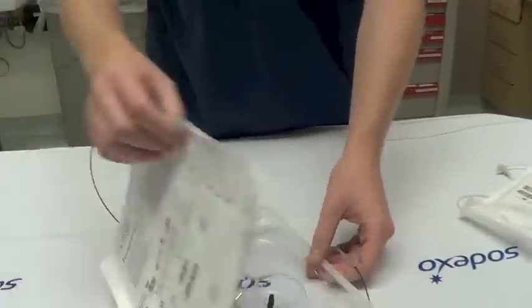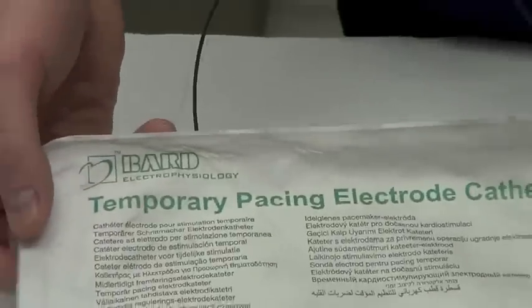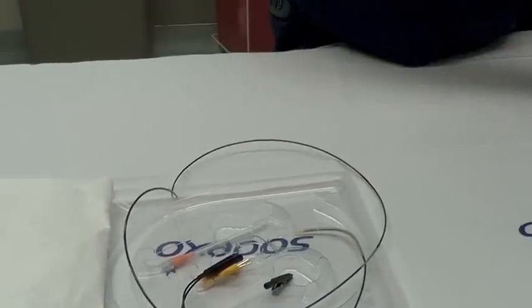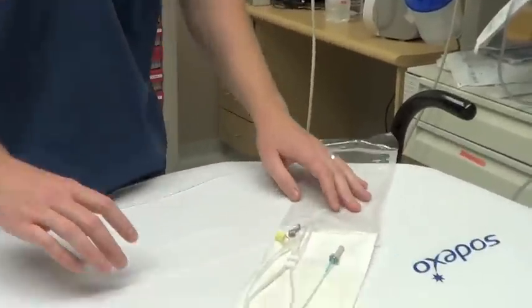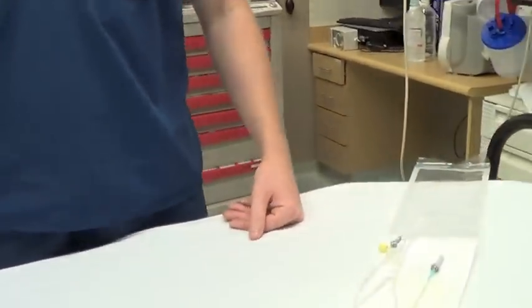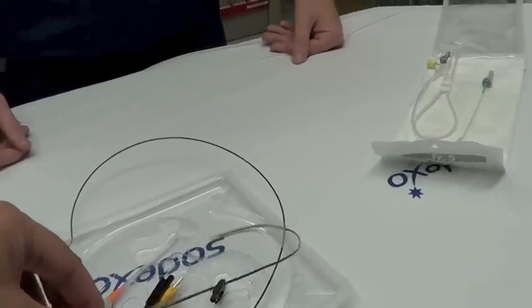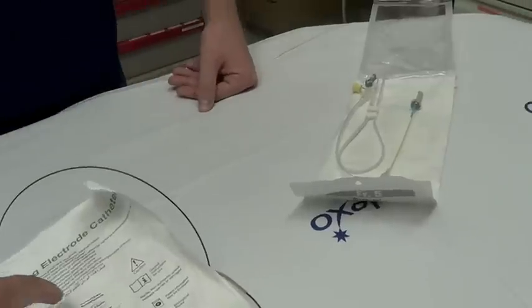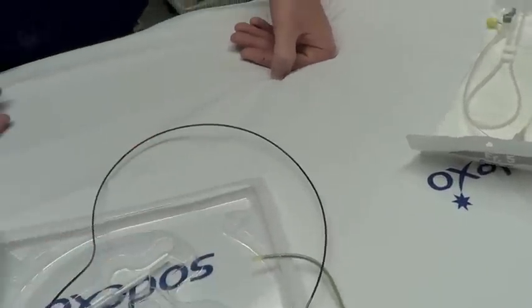Once you've got that, you also need the actual temporary pacing electrode catheter which comes in this sheath here. Go ahead and open these up with your patient. You don't want to use the nine French cordis because this is only five French and it's going to leak around in the diaphragm. There's also a pacing swan that has a balloon on it that will help you float it into position if you choose to use that.